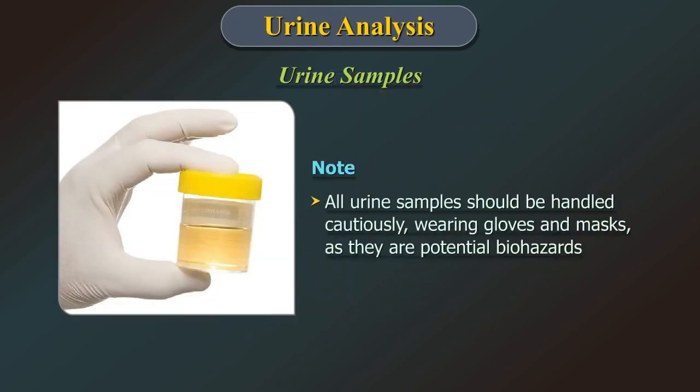Please note, all urine samples should be handled cautiously, wearing gloves and masks as they are potential biohazards.